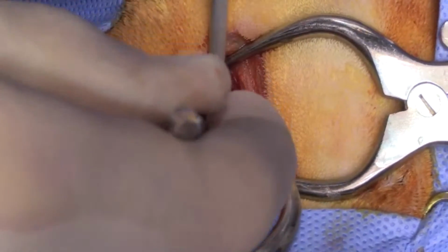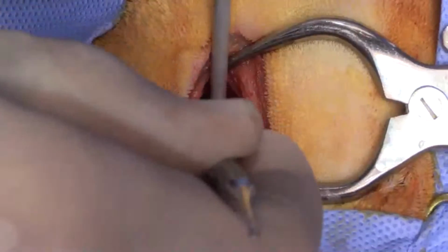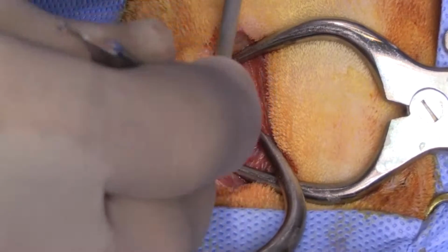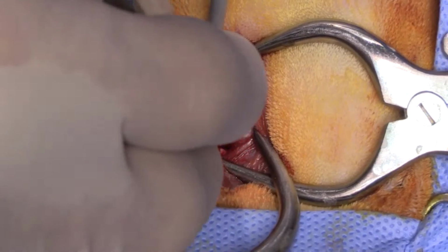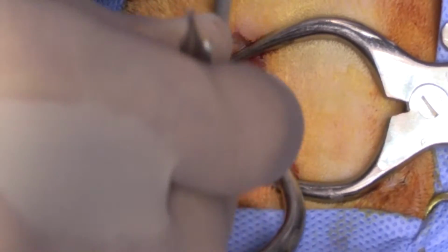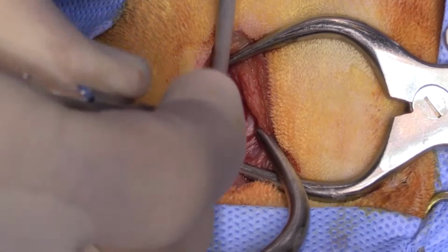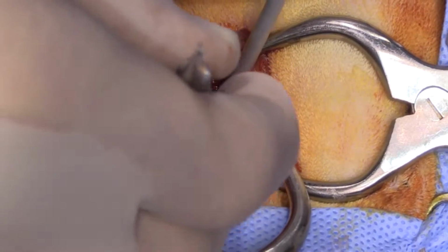Anyway, so now I'm just pulling out all of this polypoid material from the inside of that dorsolateral compartment. Again, staying clear of the dorsal bulla to avoid damaging the vestibular apparatus.